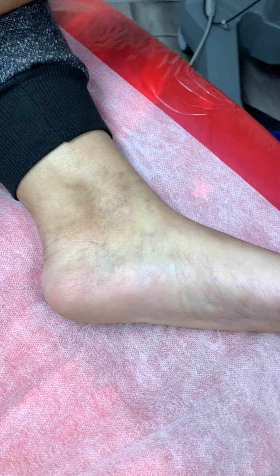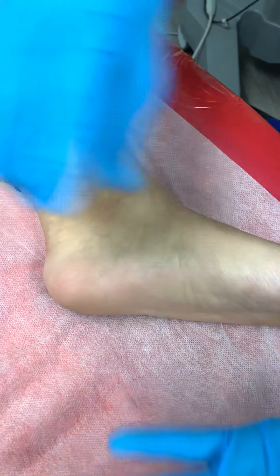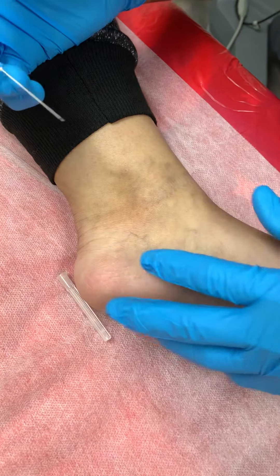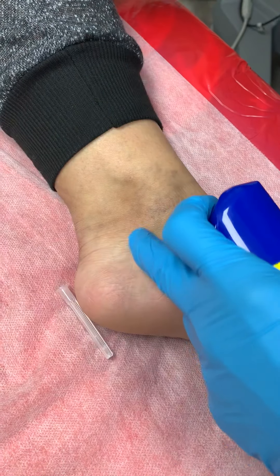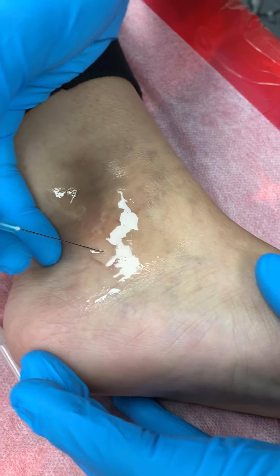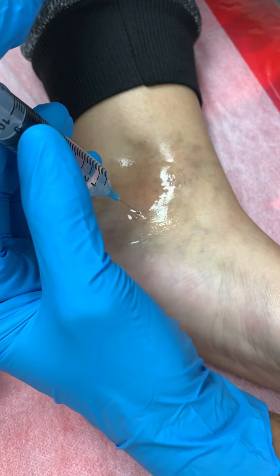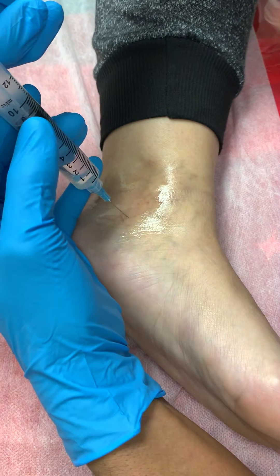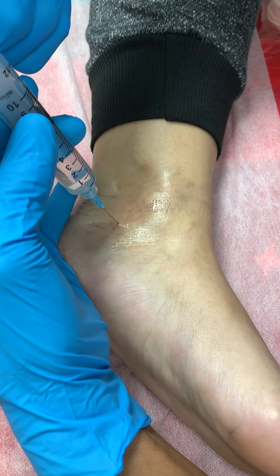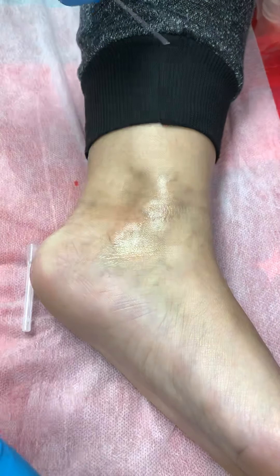A lot of our viewers are always asking us how do we numb the foot. Several important nerves to the foot and ankle — this is the inside of the ankle. We would get the area nice and numb. There's a very important nerve called the posterior tibial nerve, and at this level it's the biggest trunk, and it innervates the entire bottom of the foot.